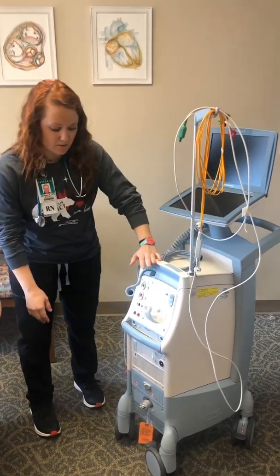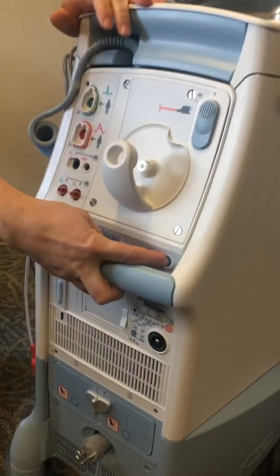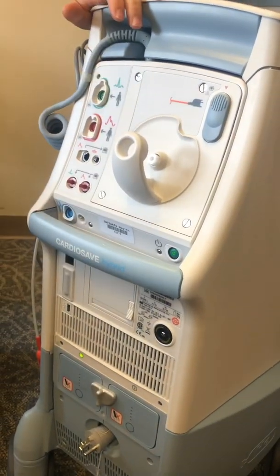First I'm going to start out with just the power button, which right here is the handle — it's going to be right under here. You just hold it until you hear the beat and it'll turn on.